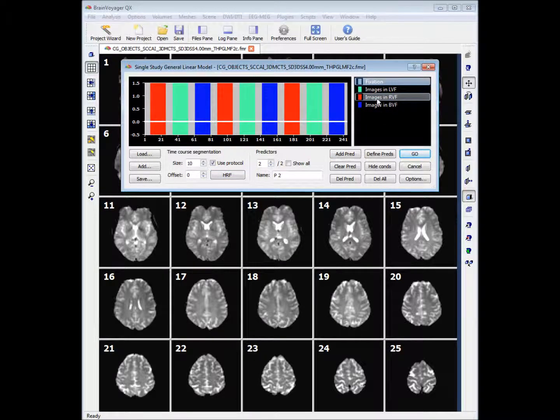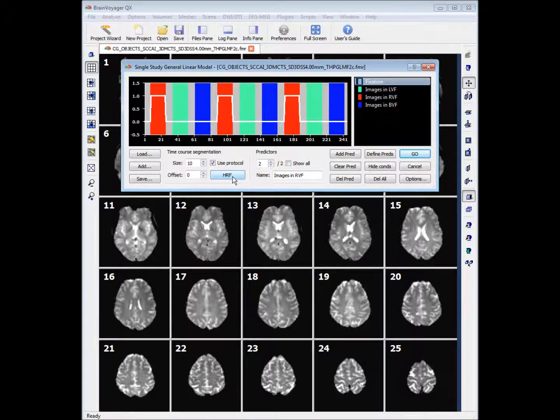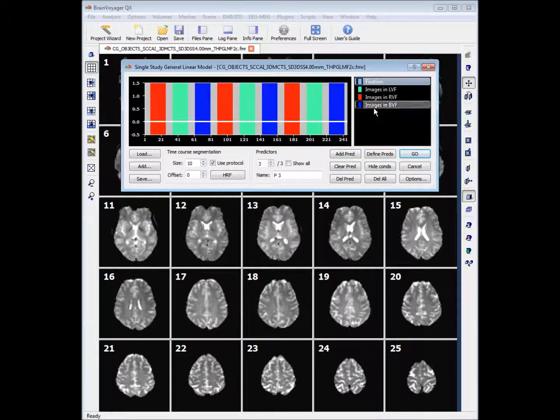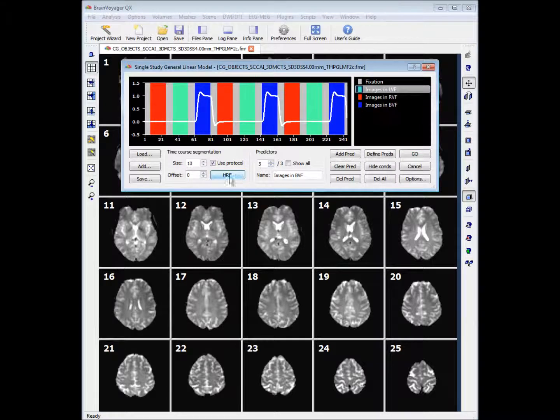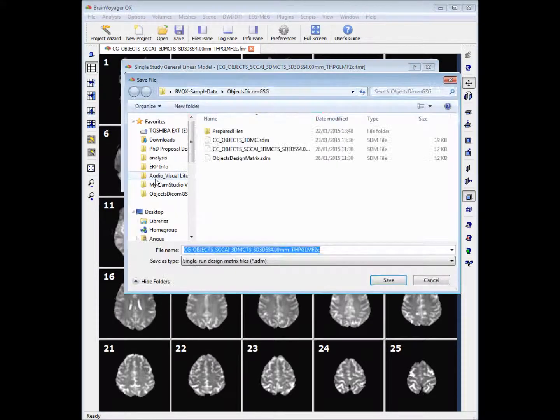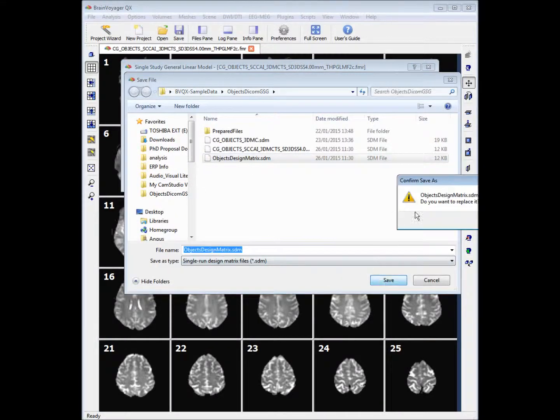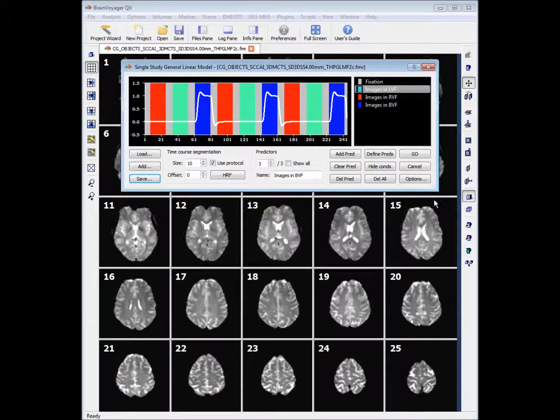So we right click Images in the Right Visual Field and apply the HRF. Then right click Images in Both Visual Fields and apply the HRF. When we've done that we want to save our design, so we'll save it as objectsdesignmatrix.sdm and click Go.